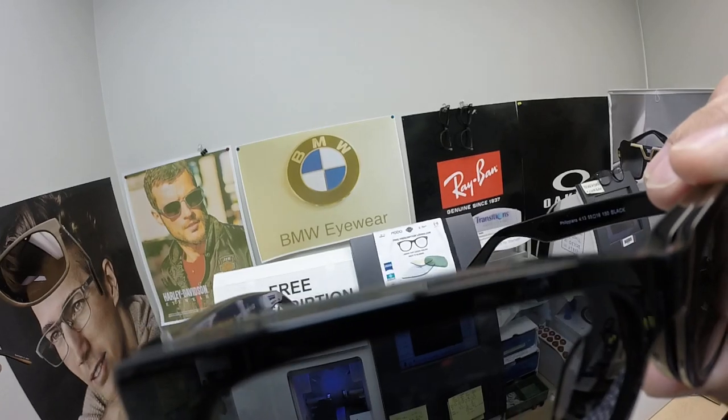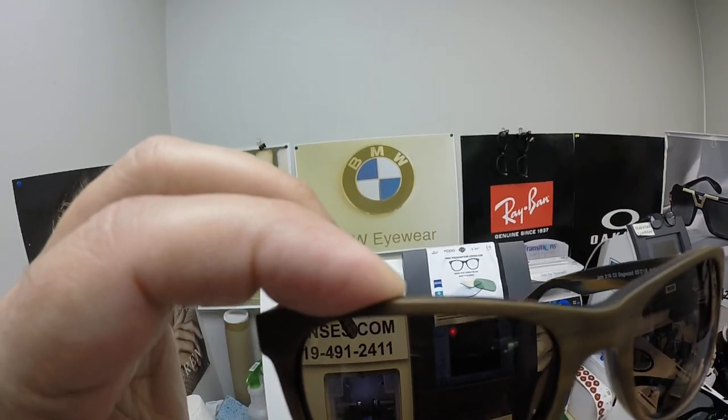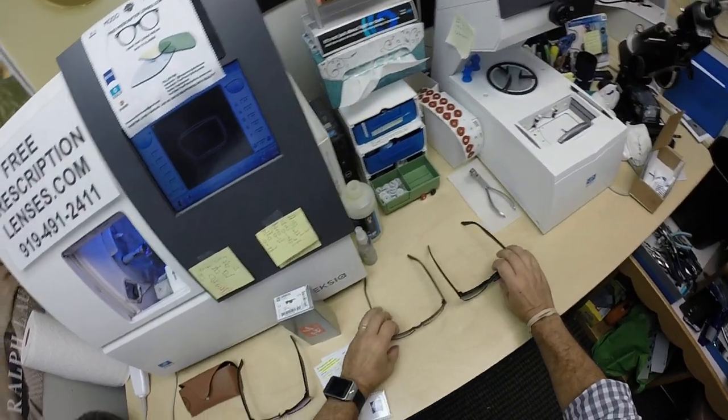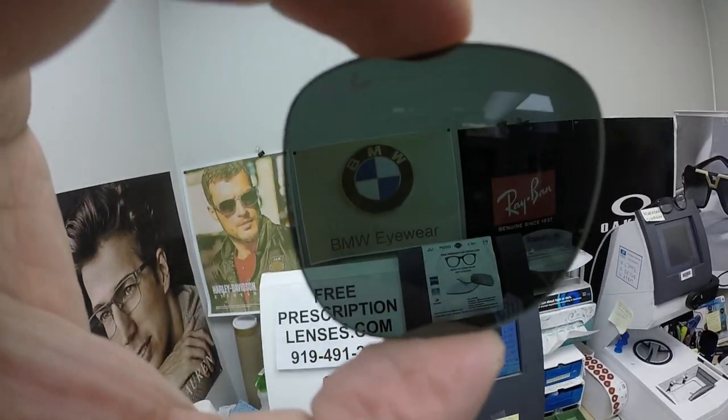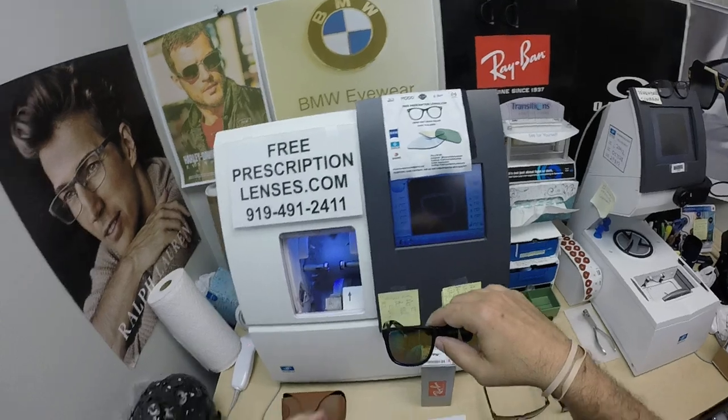Camera one. Camera two. What color do you like best — gray or brown? There's even the green G15, which I should have included. So you can look through that color and see which one your brain likes.